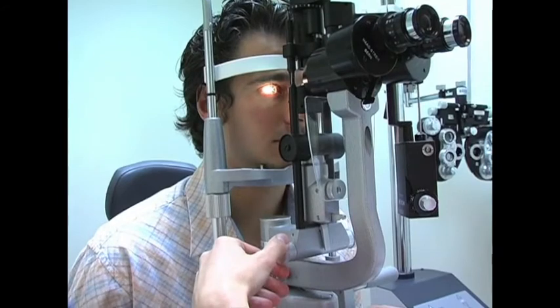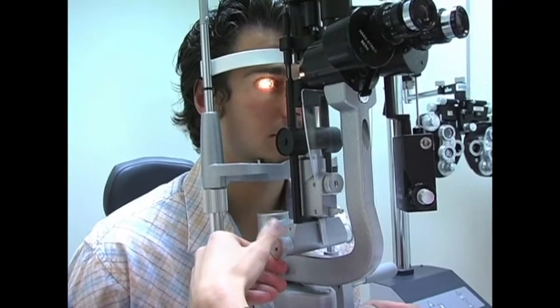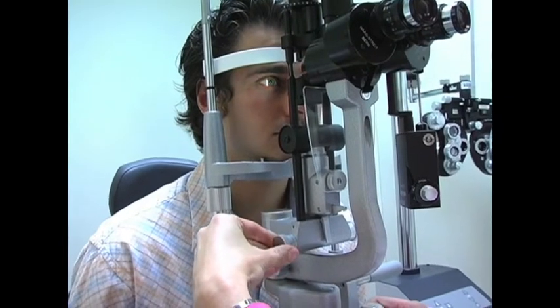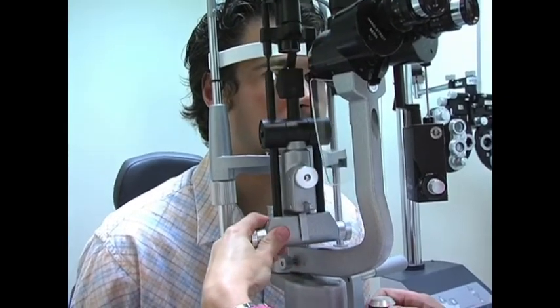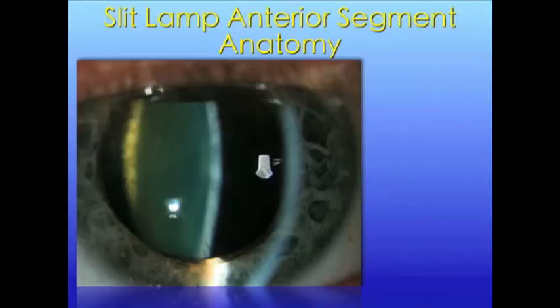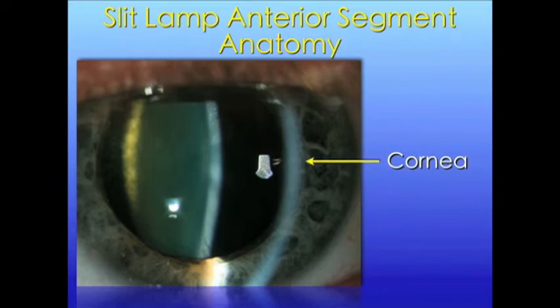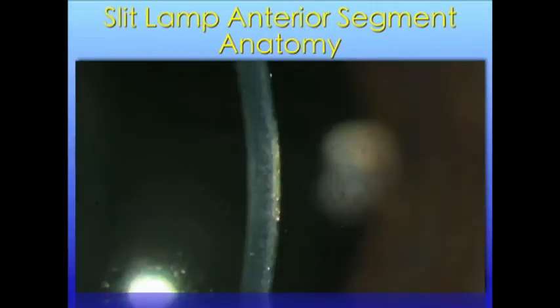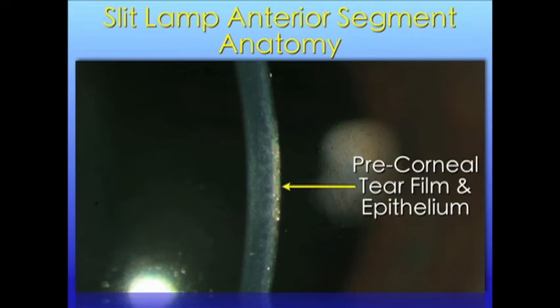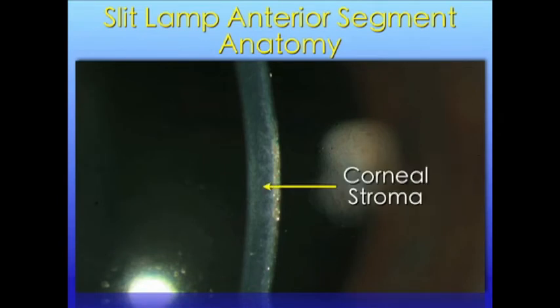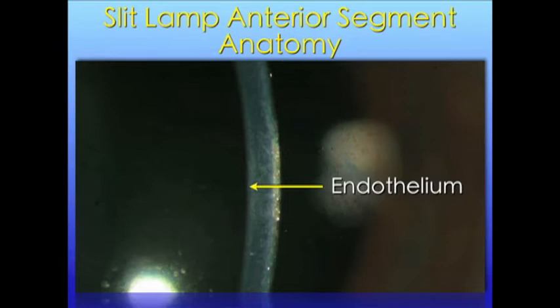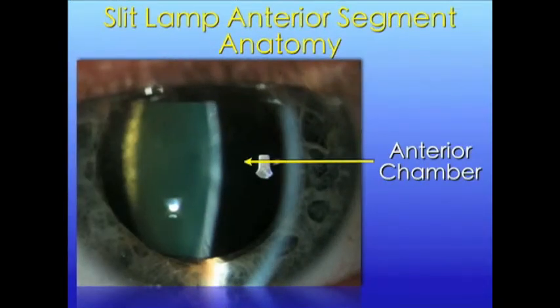Once the surface of the eye has been examined, you are ready to perform the slit beam evaluation. Using the lower knob, decrease the width of the light source to create a thin beam and move the light source to an approximately 45 degree angle. By generating a very thin beam of light directed at an angle, you are able to view an optical cross-section of the clear structures of the eye. The first structure the light passes through is the cornea, which under normal conditions is clear. The first curve is the precorneal tear film and corneal epithelium. The broad part of the beam is a cross-section of the corneal stroma, and the posterior curve is the corneal endothelium.